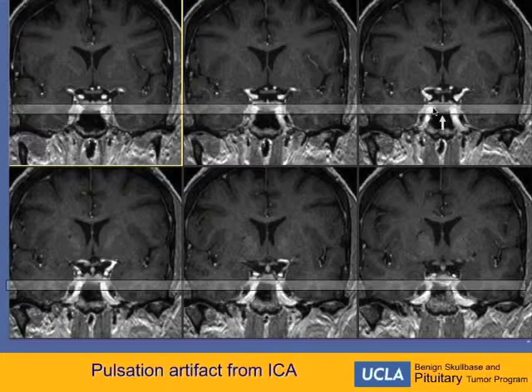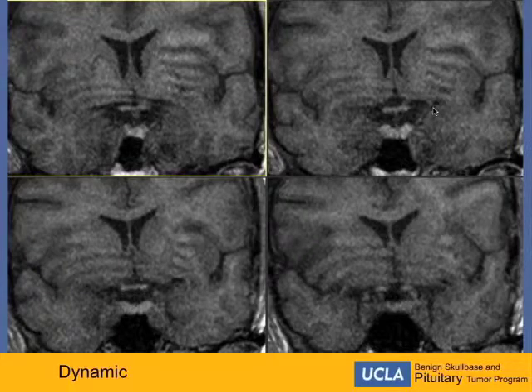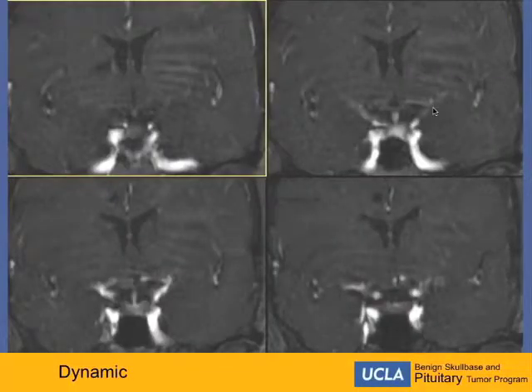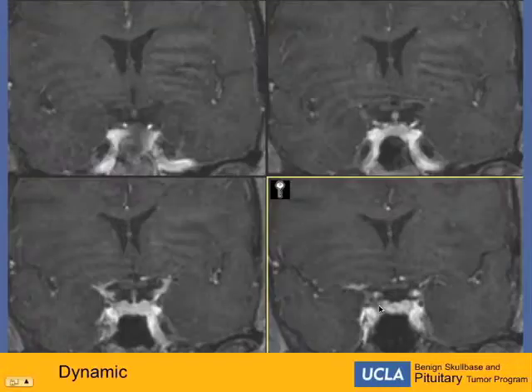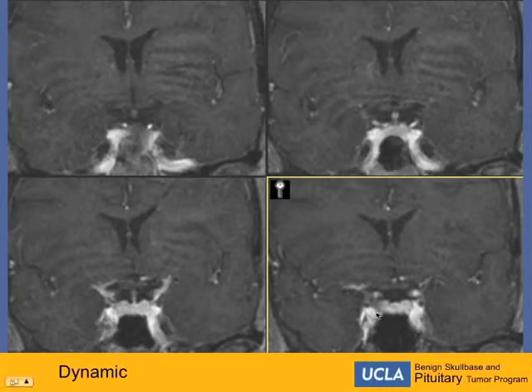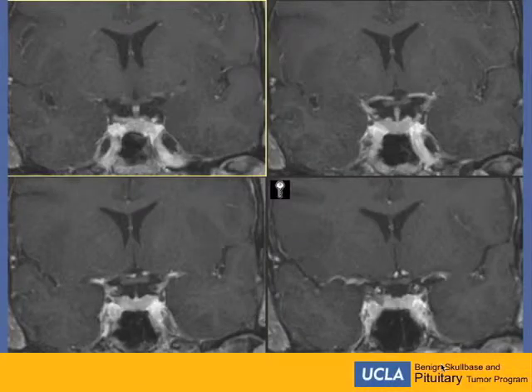If you encounter this, there are a couple of things a radiologist can do: you can flip the angle, or you can place a saturation band to prevent the carotid artery signal from propagating upward. All these adjustments can be made. In this patient's dynamic study, going through every couple of minutes of the dynamic scan, there is again a little hypo-enhancing focus. In a slightly delayed dynamic phase, you can see homogeneous enhancement on the other side, while this right-sided portion is not enhancing. So the dynamic wasn't really needed here since the target was already visible without it.